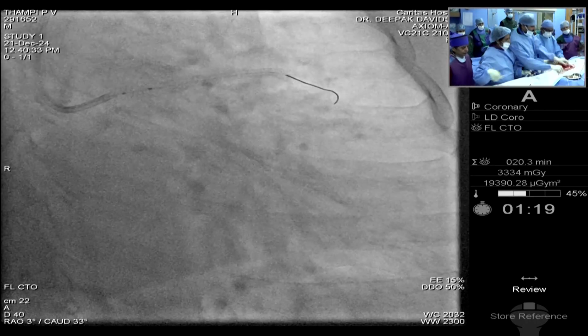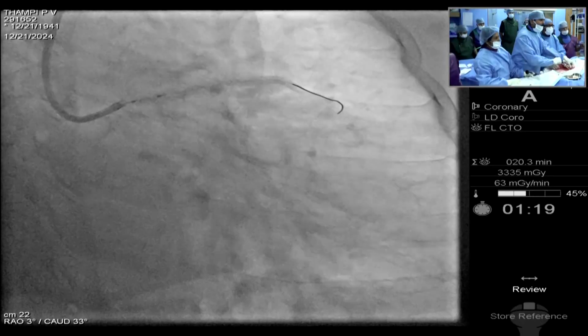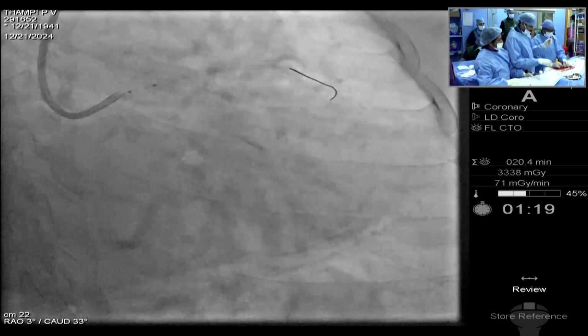Okay, now we'll come. Okay, now the OCT catheter.